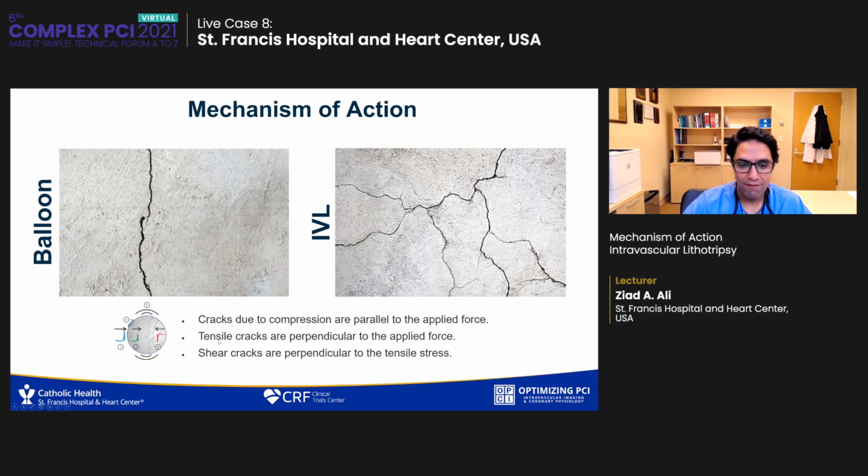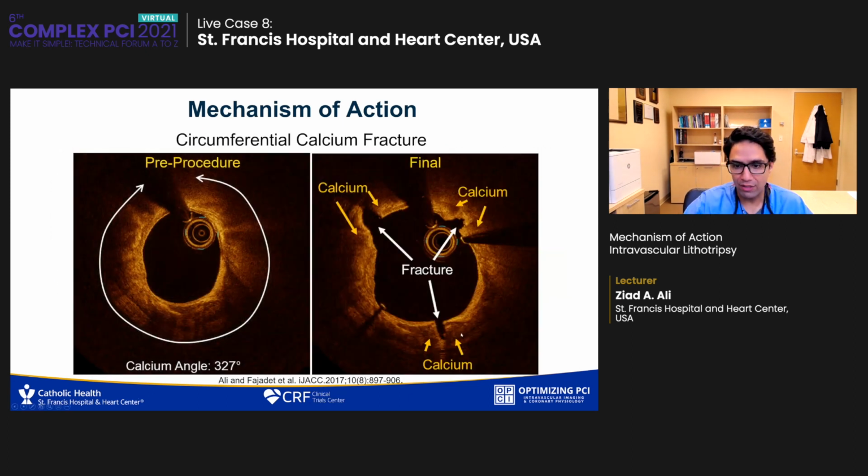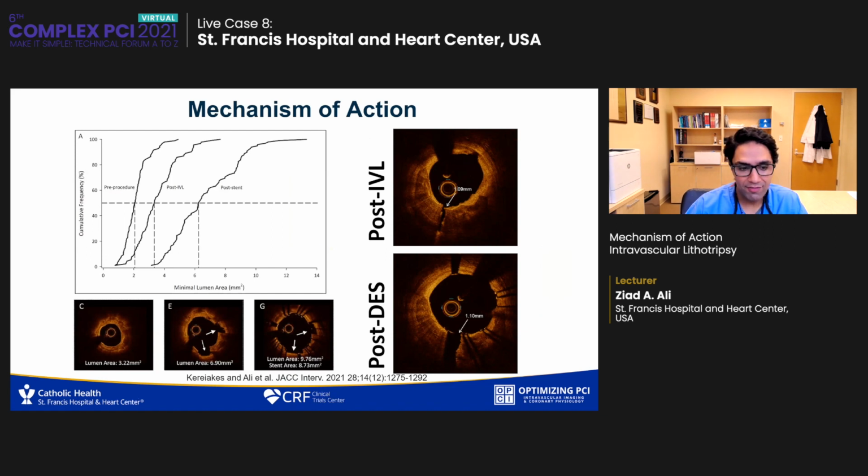But when you have tensile force or shear force, those cracks actually happen perpendicular to the applied force. That's why a balloon behaves in this fashion, but IVL probably happens much more in this fashion, because of the multiple mechanisms of action. Now we're all used to these pictures, which are the linear cracks that we can see in the calcification, and it's much harder to see these chips that might occur, but it is likely that they do occur.